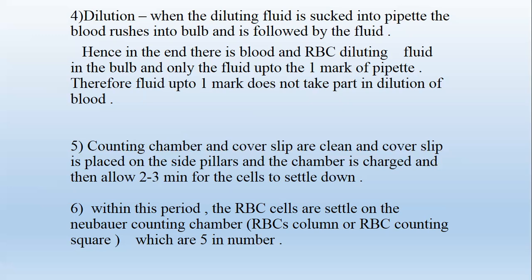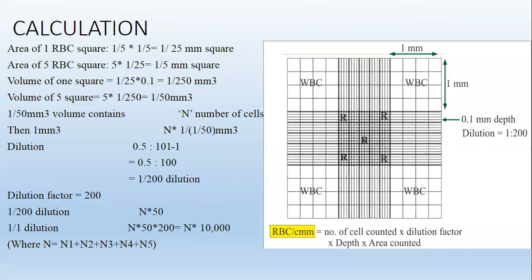Within this period the RBC cells settle on the Neubauer counting chamber in the RBC counting squares, which are 5 in number. These are the RBC counting squares: N1, N2, N3, N4, and N5. These are the WBC counting squares.